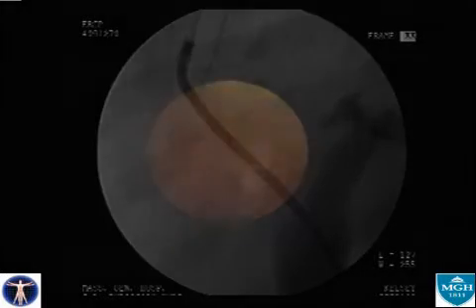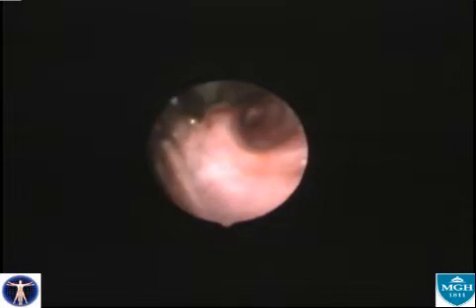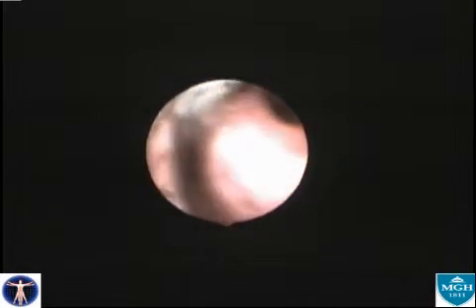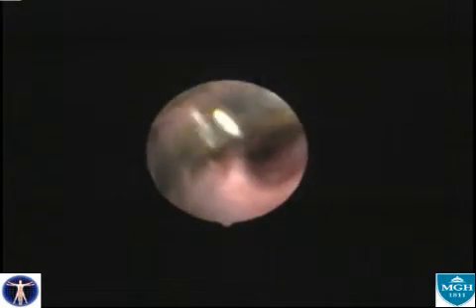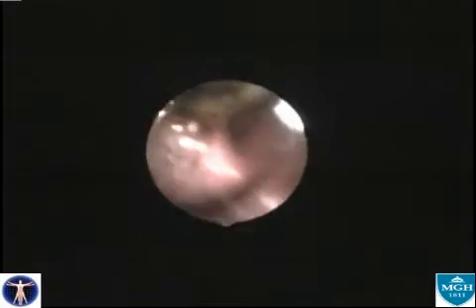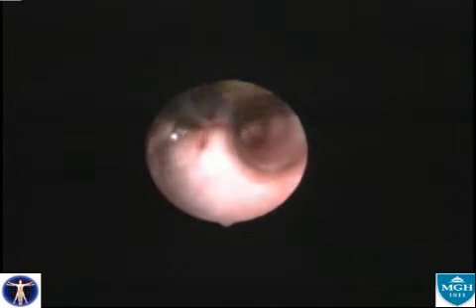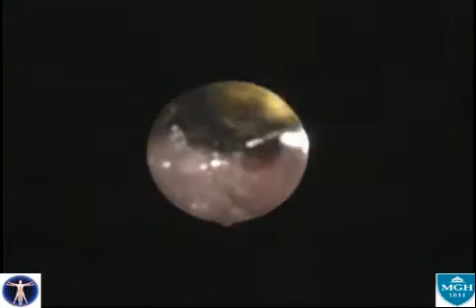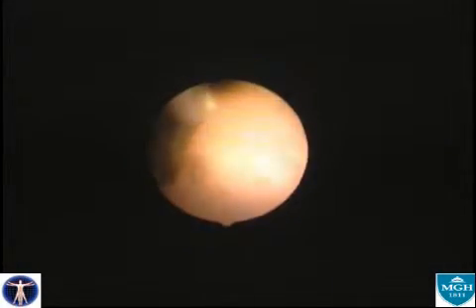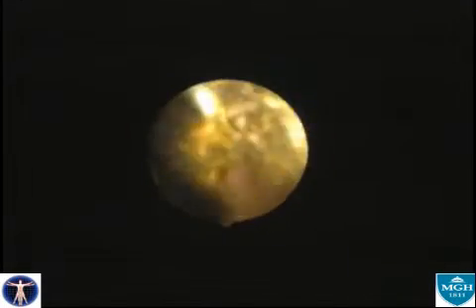The entire region can then be inspected. The mucosa in these ducts appears to be normal without additional stricturing or suggestion of mass. The single stone is easily identified. While this stone could be trapped in a basket under direct visualization, it may be too large to pull down through the stenosis. Therefore, stone fragmentation using EHL is performed. This proceeds quickly as these stones tend to be soft. These fragments can then be flushed out.